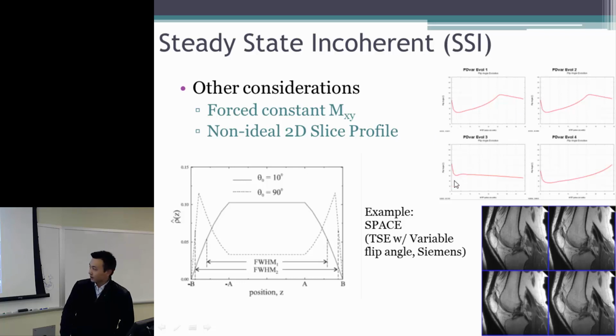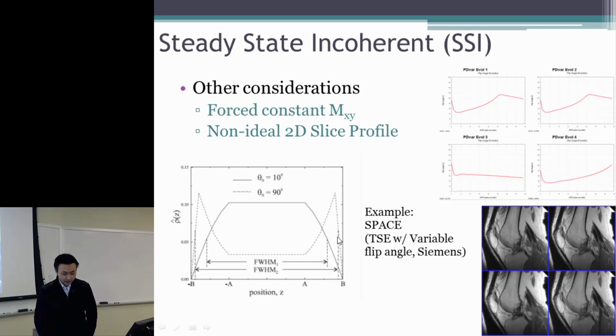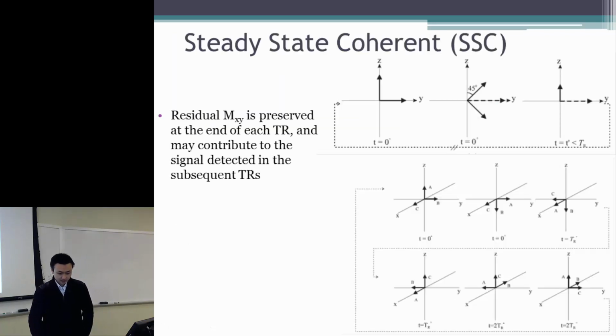So corresponding to these different schemes, we can clearly see, well, not quite clearly here. Maybe you can see it more clearly if we put it into the PDF. We can see the difference in the vessels. We can see a very different representation of the vessels in this knee. So, yeah, maybe we can take it over later.